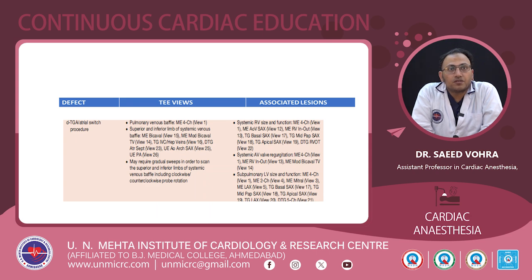For TGA patients operated for atrial switch operation like Senning and Mustard, the pulmonary venous baffle can be seen in the mid-esophageal 4-chamber view, and the superior and inferior limbs of the systemic venous baffle can be seen in the mid-esophageal bicaval view, modified bicaval view, transgastric IVC hepatic veins view, upper esophageal aortic arch short axis view, and upper esophageal PA view. It may require gradual sweeping in order to scan the superior and inferior limbs of the systemic venous baffle, including clockwise and counterclockwise probe rotation.